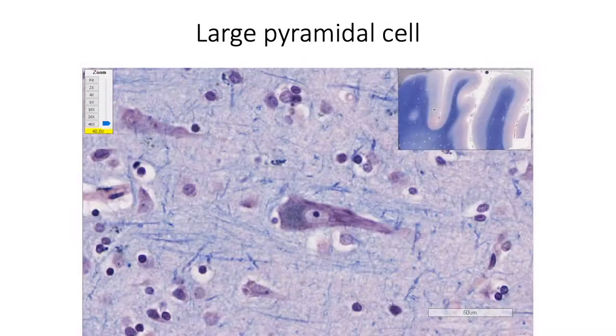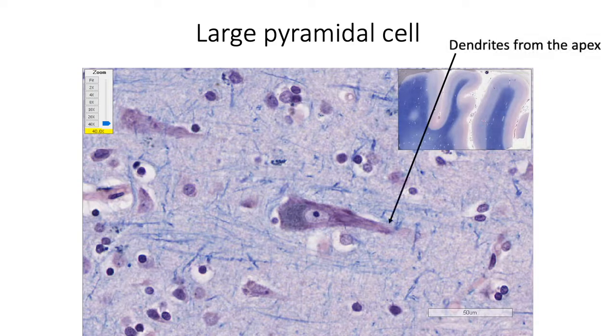In case of pyramidal cells, dendrites arise from the apex projecting towards the surface, and axon arises from the base of the cell facing the white matter. The pyramidal cells of different layers will contribute to different type of efferent fibers. That is, the axons of the smallest pyramidal cells in the layer 2 form the short association fibers. Axons of the small and medium pyramidal cells in the lamina 3 will form the long association and commissural fibers.